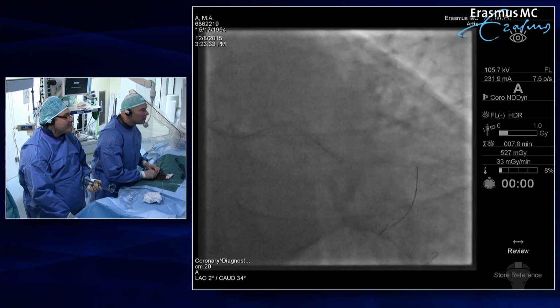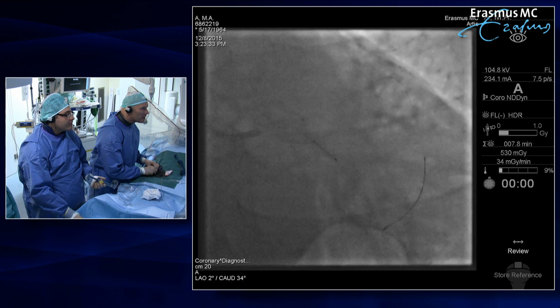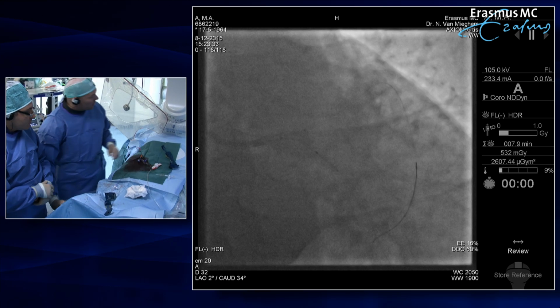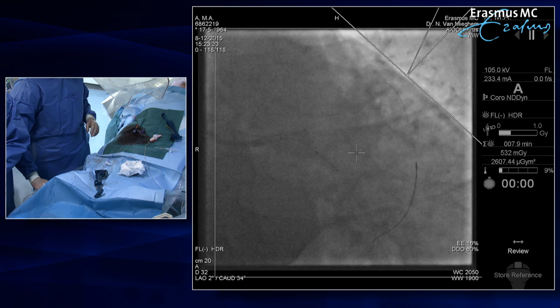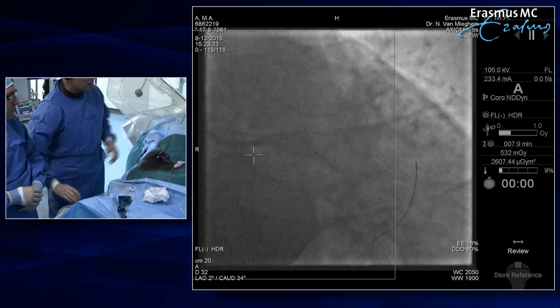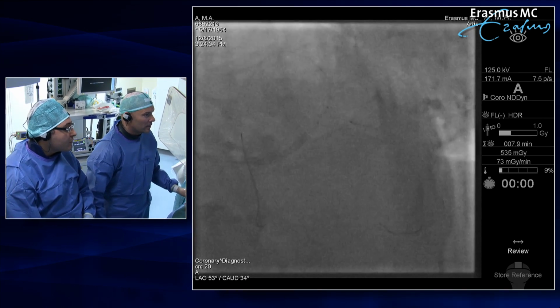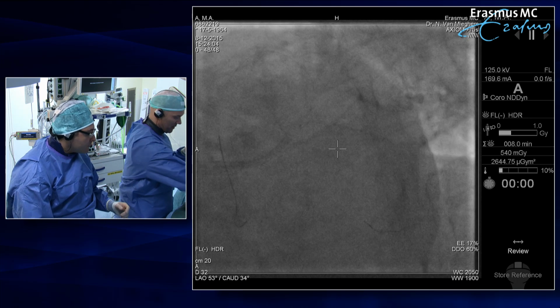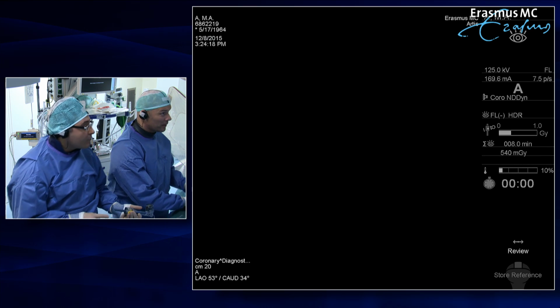So our patient is perfectly stable. So we are very relaxed at the moment. The balloon goes easily. So I really landed there on the bifurcation, on the carina. So let's go back to our spider view. Can I have the reference of the spider as well? Okay, so this is the stent. So let's go, you have the stent? Yes. Okay. So there we go.